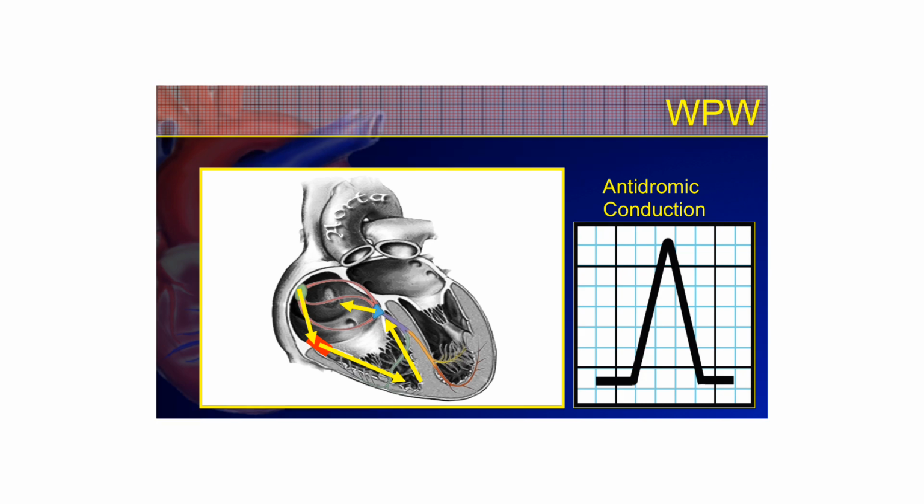You could also have what they call antidromic or orthodromic reentry, but we'll talk about antidromic reentry because that's the scary one. Antidromic reentry is when conduction doesn't follow the physiological pathway at all. It just goes down through the accessory pathway, and comes back up through the normal physiological pathway back towards the atria, and you're going to get what they call a re-entry phenomenon here. Those can get pretty fast, and this can degrade into a ventricular tachycardia pretty quickly, so you need to be ready to treat these patients.